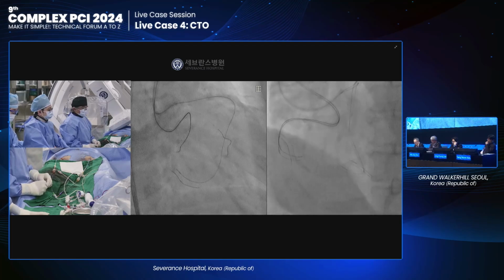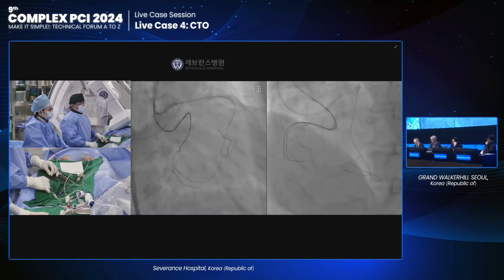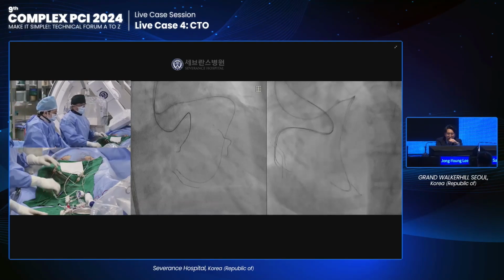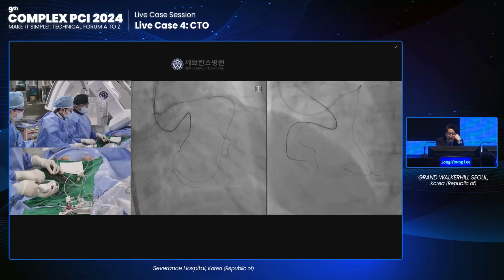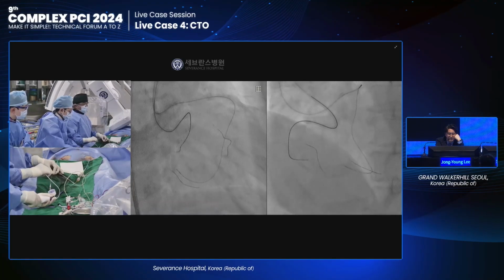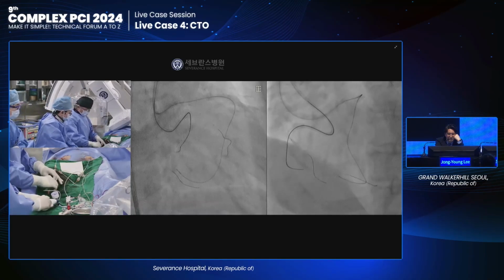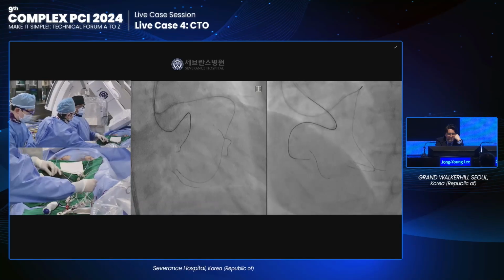If I were you, the UB3 tip morphology and action was not good, so I think we already have the distal wire as a landmark, so even Gaia Next second or third is okay, I believe. Okay. Yeah. So I want to change the Gaia series.